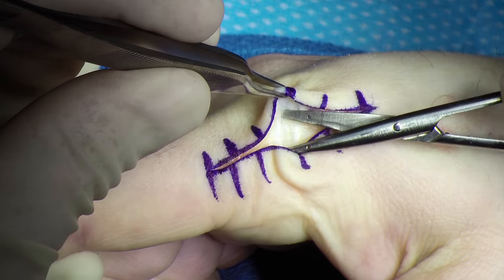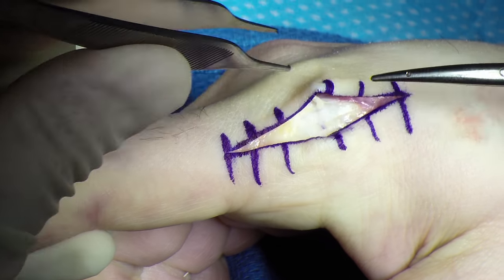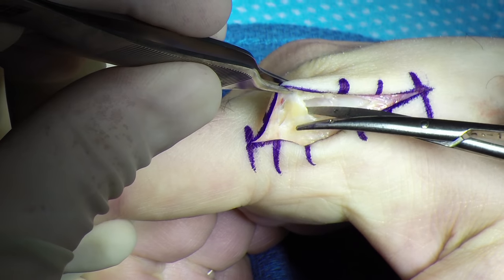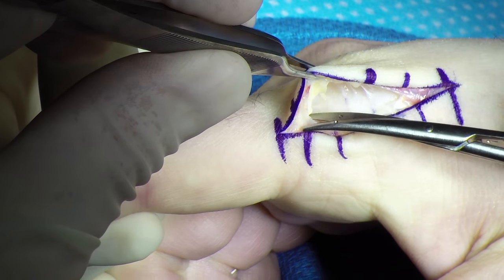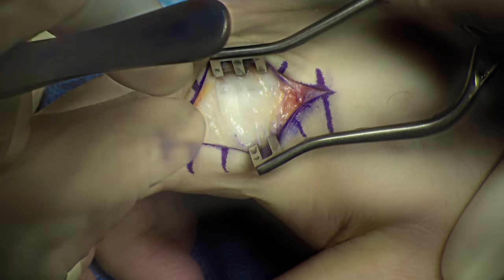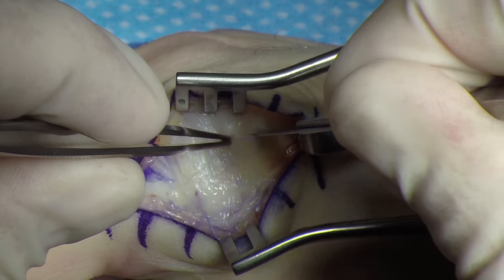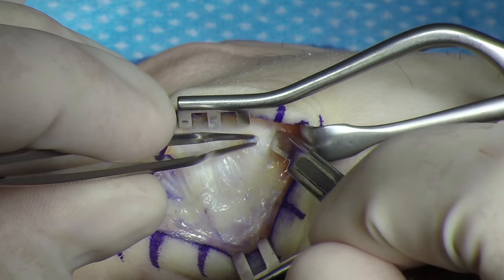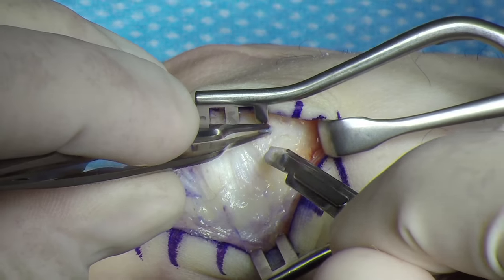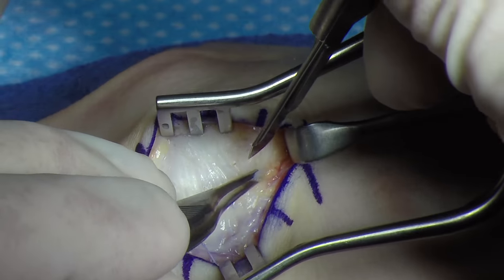A longitudinal incision was made over the radial aspect of the metacarpophalangeal joint. When performing this reconstruction, it's very important to preserve the sagittal bands. This allows early range of motion as well as prevents extensor tendon instability post-op.